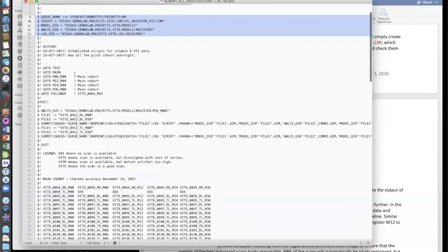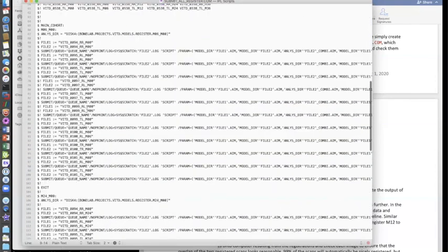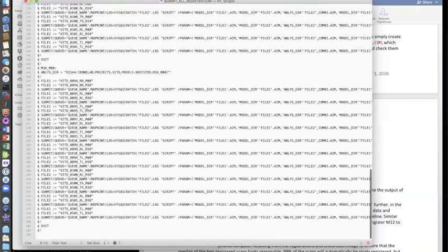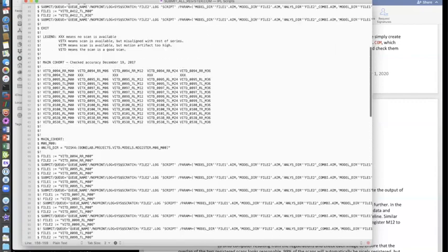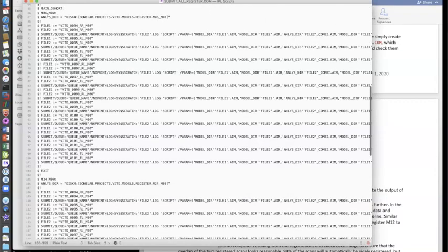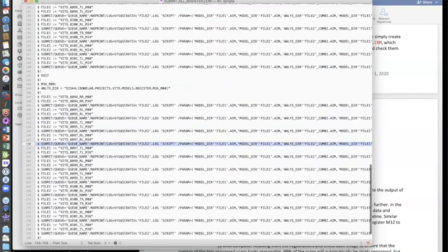And then I have some go-to statements here. I've actually edited down these files a lot because they're thousands and thousands of lines. I just showed the fundamentals of how it works. But these are basically from month 36 to month 0. I noticed I accidentally deleted the month 12 to month 0 here, but somebody else will recognize that, hopefully. I define the analysis directory. I define file 1 to file 2. So I'm registering month 36 to month 0. These are parameters that go into this line here. This line basically uses all those variables that were defined at the top to submit the script to the queue and run it.